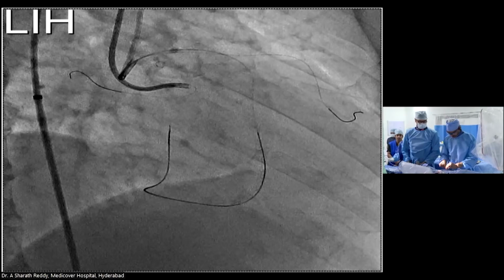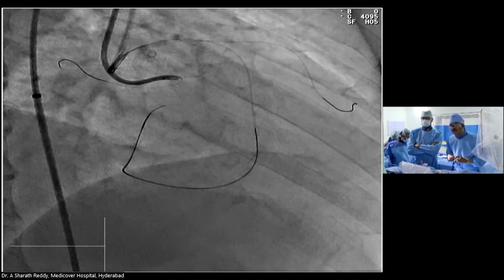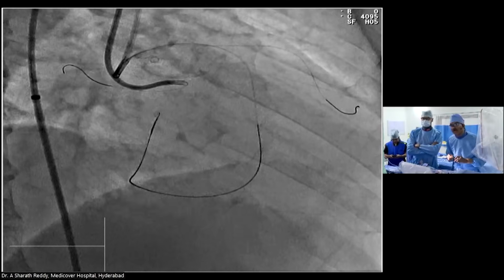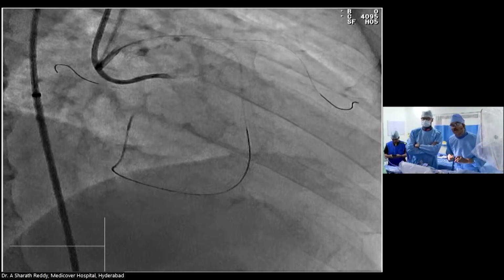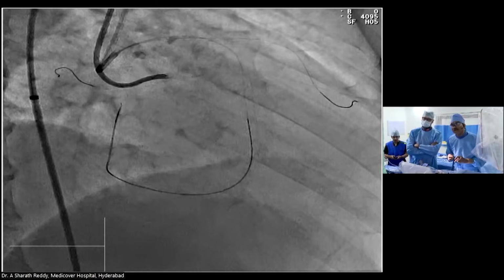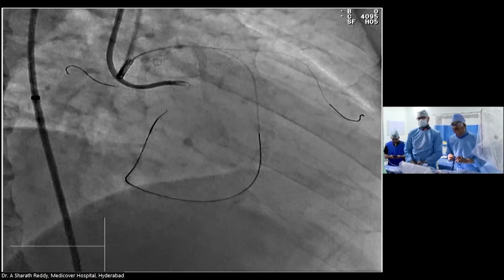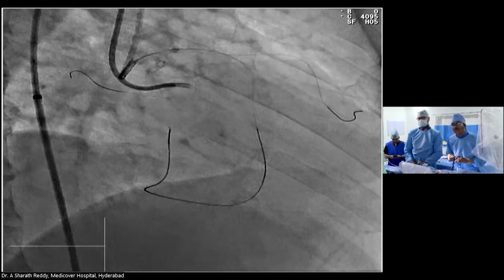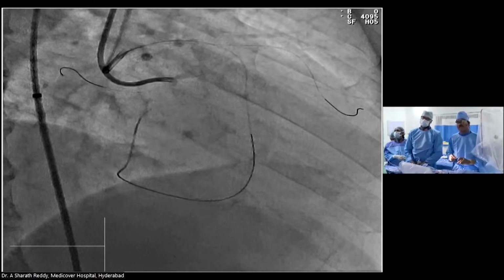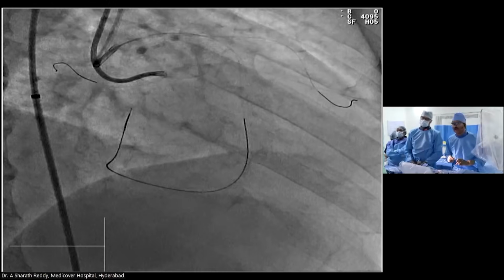So this is exactly what I had a presentation on today: the problem of switching from antegrade to retrograde. He tried everything antegrade, but still the problem is that you have no wire marking the proximal cap, even if it would be subintimal. So now you have to blindly find a way at the distal ambiguous cap because you have no target. You can see the wire is just jumping into the side branch. Yeah, so you need something stiff.